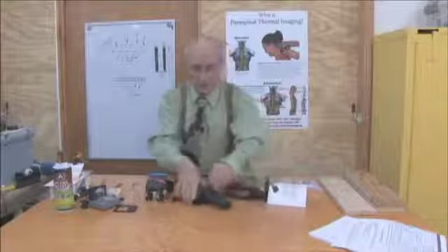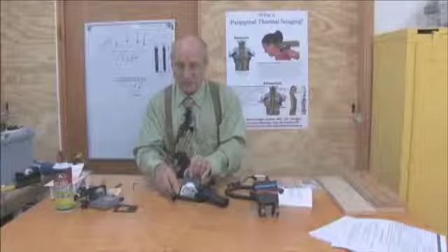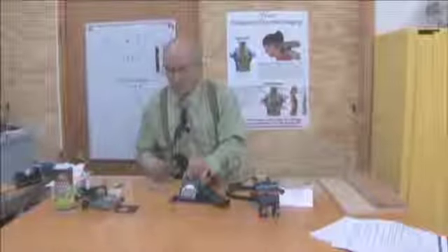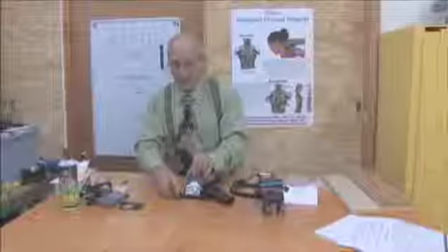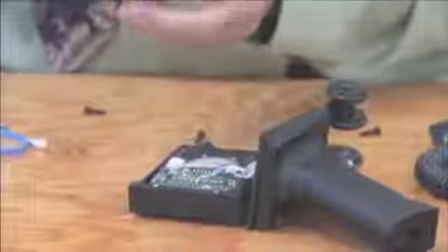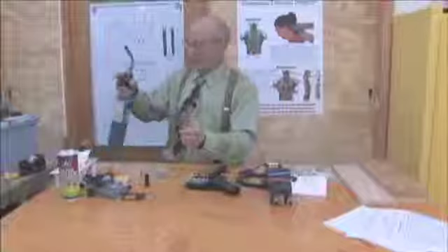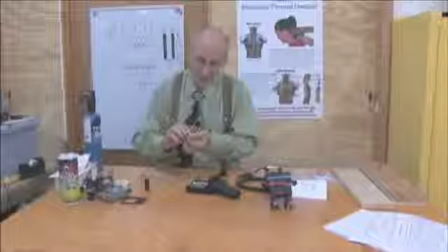When a scanner falls, some of the screw is usually sheared off and left in the scanner. And we're going to zoom in and show you how that can be removed very easily. If you have a metal screwdriver, usually Radio Shack has beautiful little kits, and you should own a kit anyway. Get a Phillips head metal screwdriver, and you can heat it with a small butane cigarette lighter. I prefer a torch. A gas stove does a fine job too. A match isn't quite enough.